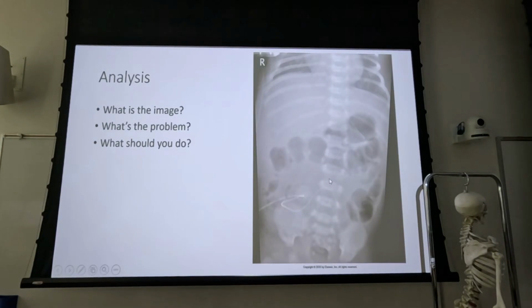Again, pediatric patient, what are we shooting this for? Pediatric patient, could this be a UVC, a central line? What are we doing here? Ask before you reshoot these pediatric patients. I mean, this is almost a whole body dose. I'm sorry, I said that was central line. That's NG. That's a feeding tube.